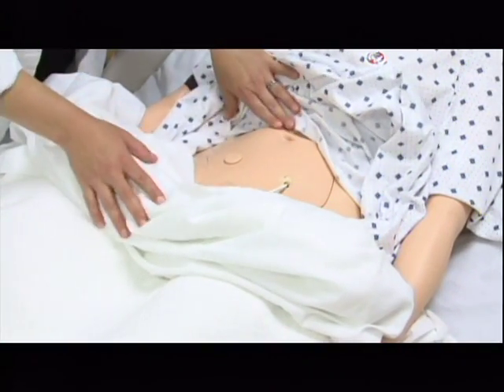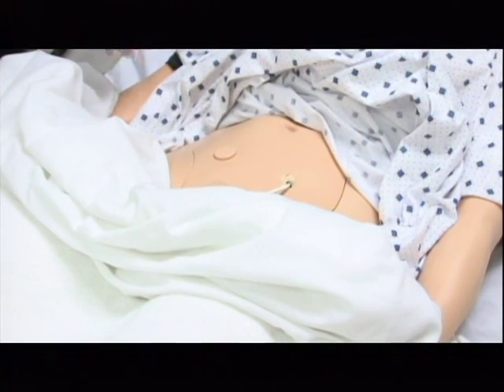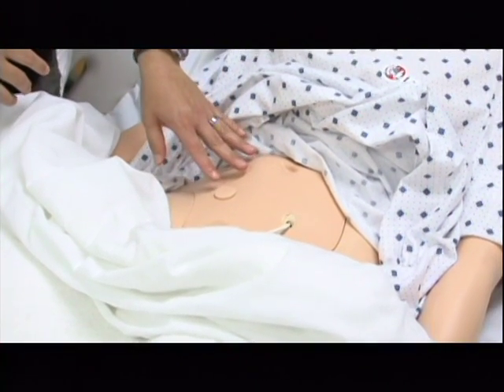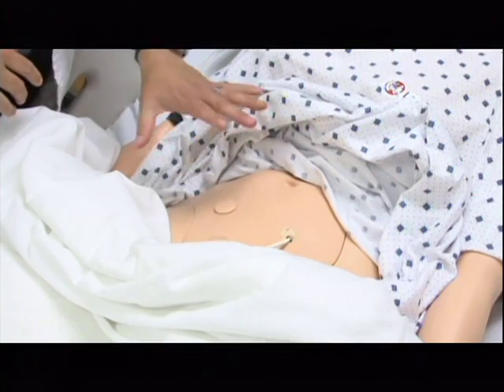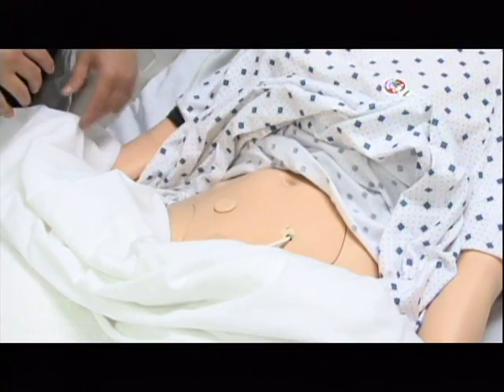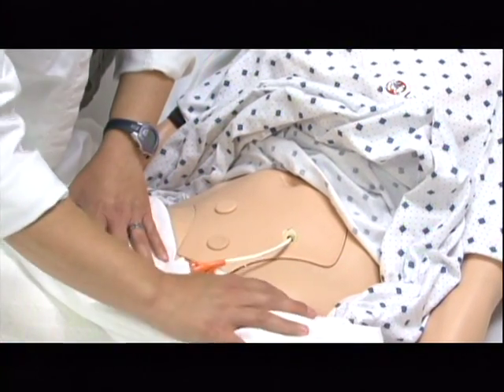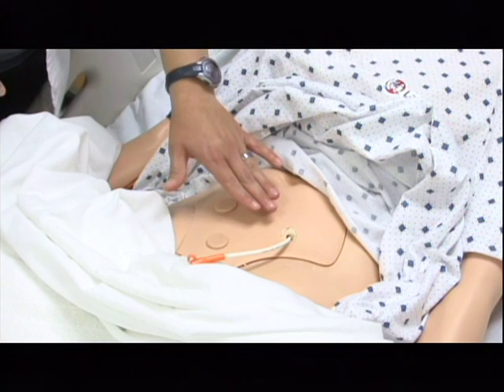Now, if you'll remember with the abdominal area, you always want to inspect first, and so I'm going to be looking at her abdominal area. I'm going to make sure that I don't see any distension, and I need to make sure that there aren't any open wounds or areas. I need to also look at the tube, and I need to assess the appearance around the site.